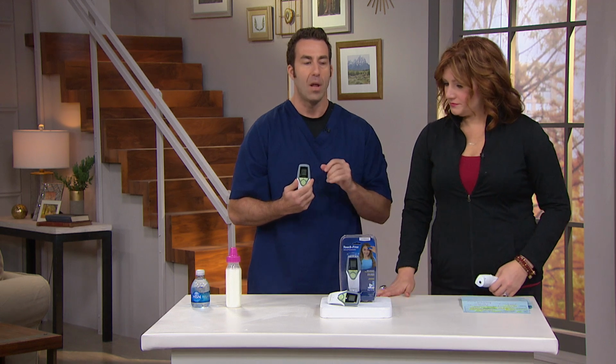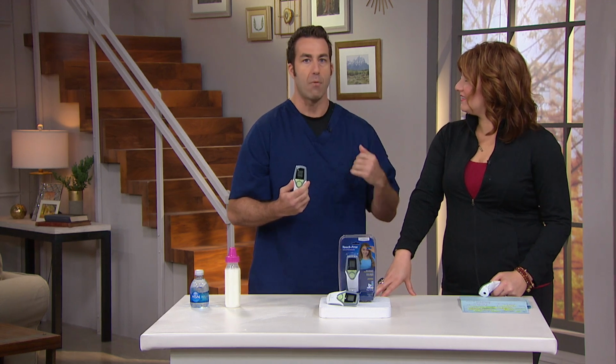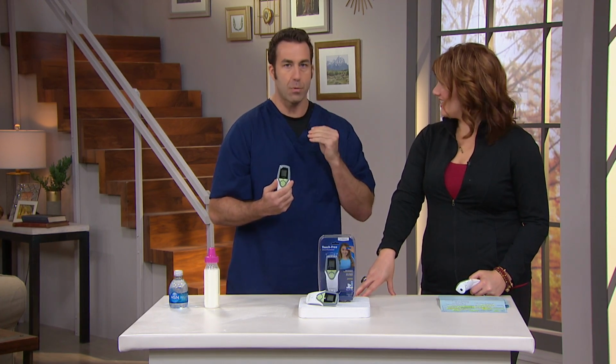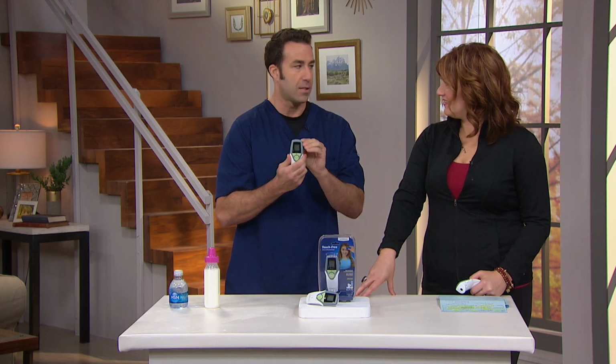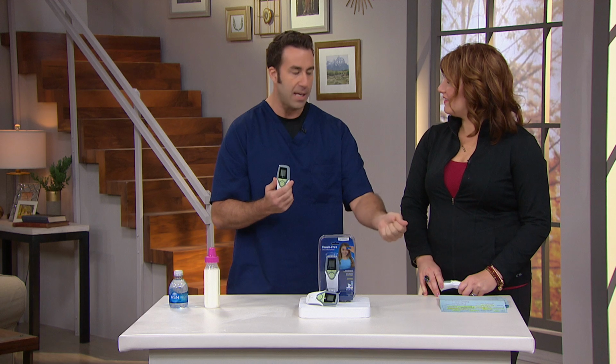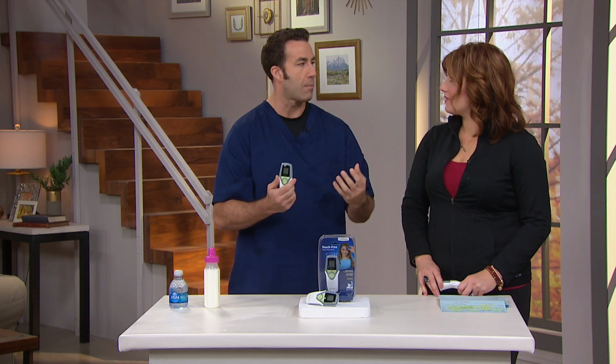Back to my example. I got out of work last week, okay? I wind my day down and I was very sick. I had a sore throat. I wrapped myself in a blanket. In a couple hours, I woke up and my teeth were chattering. I reached for this, okay? And I checked my temperature, it was 102. I knew I was in trouble, okay? And I like to drink tea, hot tea when I'm sick. A lot of people do. So I could check that temperature of the tea, check my temperature to see how I was trending, and then kind of monitor my progress as I go.